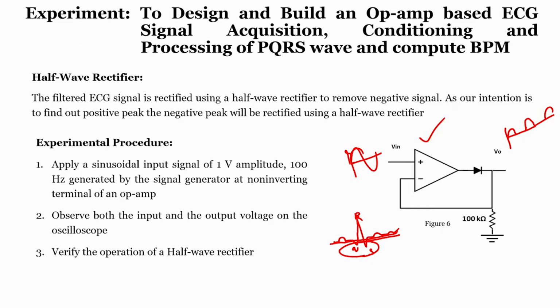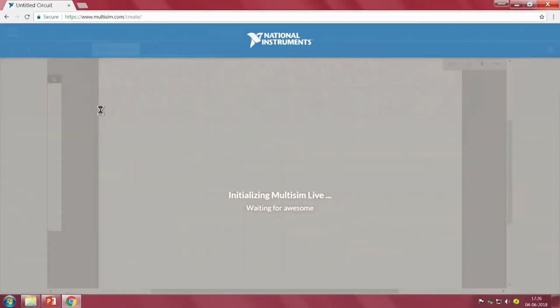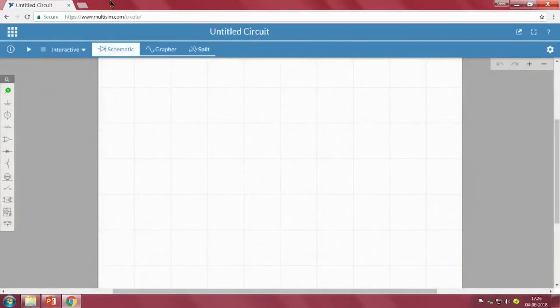To understand that, we will do a simulation. Now, what do we require?